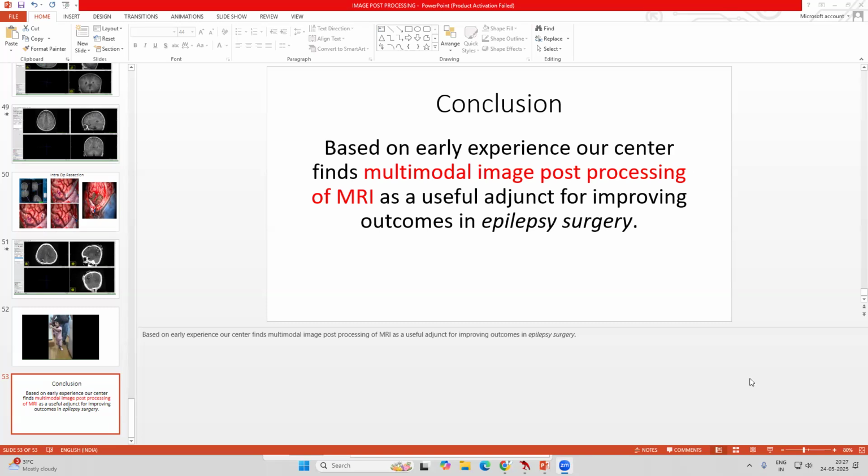My next question is a little more, not philosophical, but maybe pathophysiology. In focal cortical dysplasia, there is gray matter thickening. And on FDG PET, you're seeing on an interictal scan hypometabolism. Gray matter is the one that takes up FDG more. So logically, you would expect to see increased uptake because it's thickened gray matter. So what's happening in the gray cells there that they are hypometabolic in spite of being thickened?